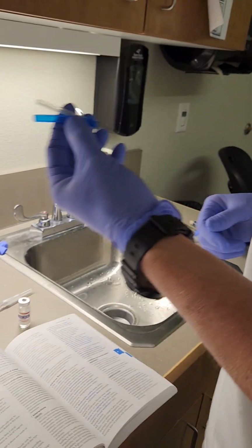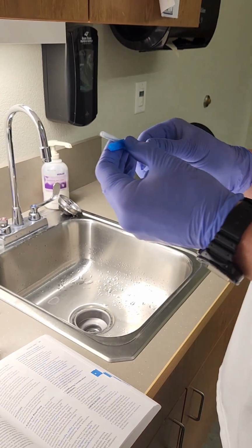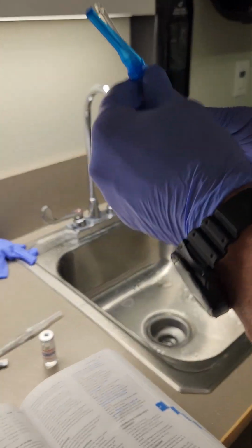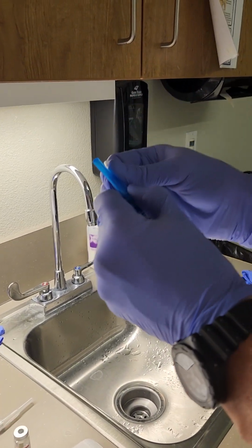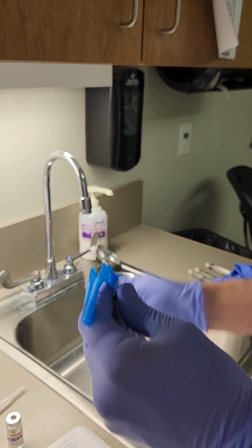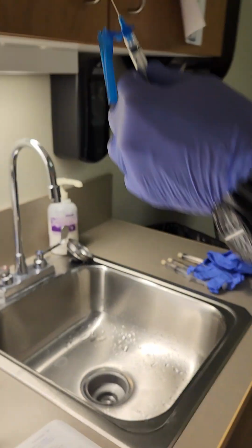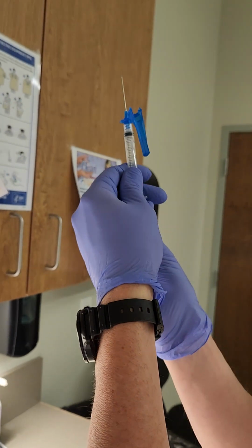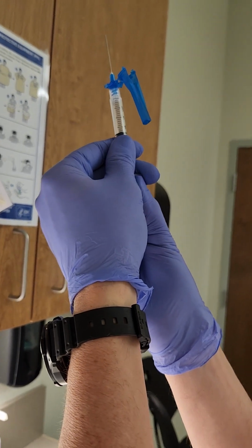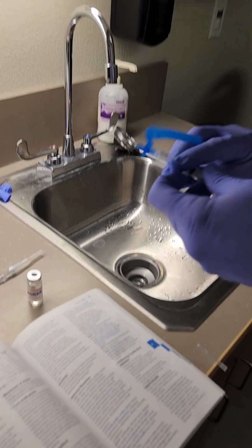So I've got my needle, I've got a syringe that I am going to hook up. All right, I'm going to take this off, and I'll put that right on the edge there. And I'm going to get 2 milliliters out. So I need to put 2 milliliters in. All right, there's that.